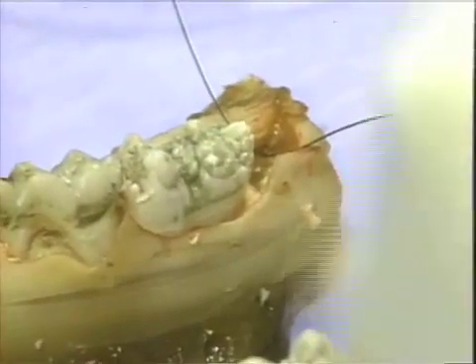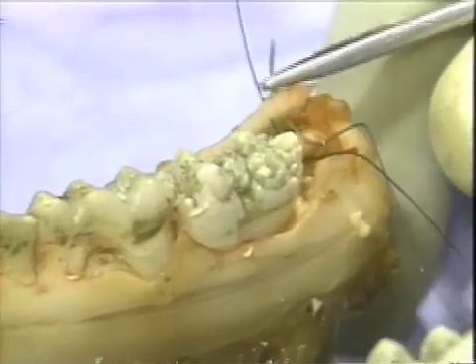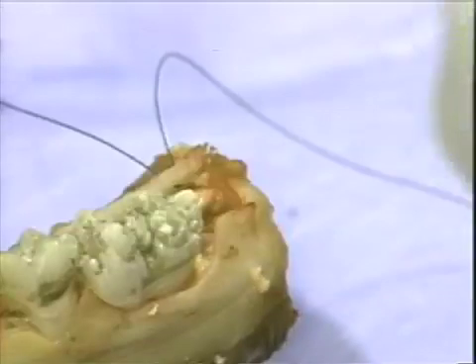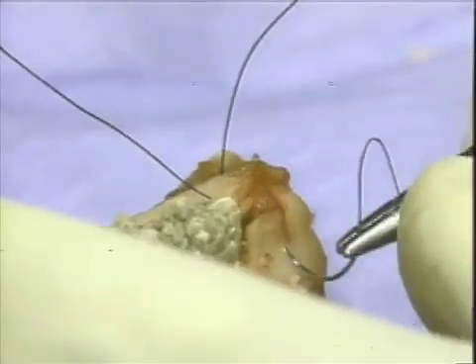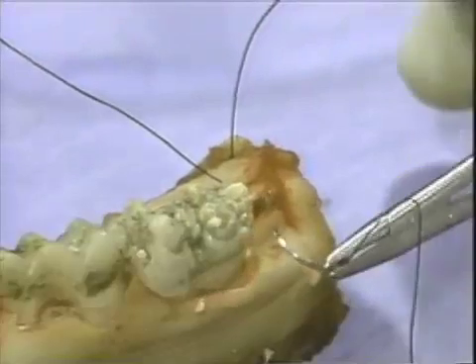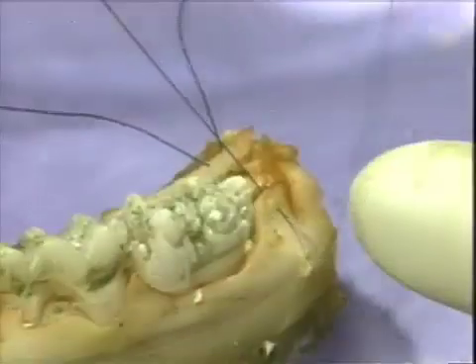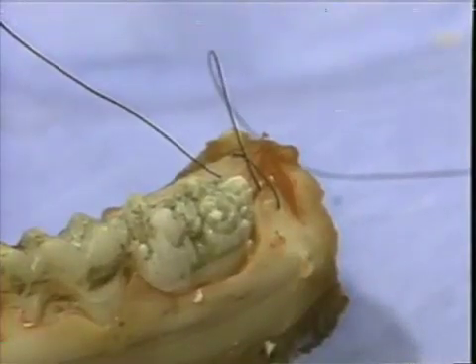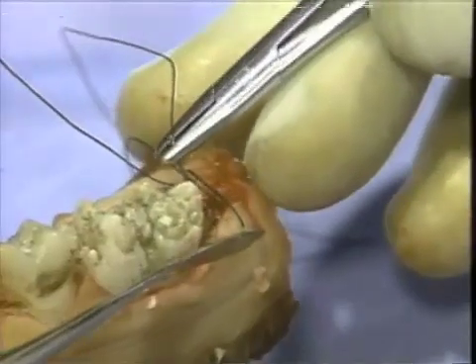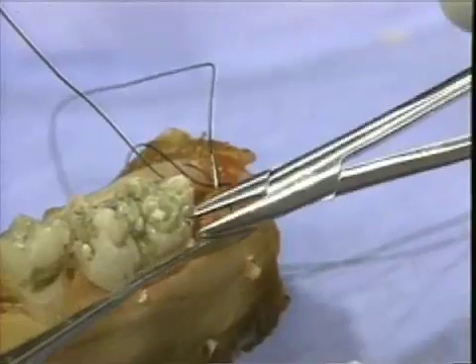The external mattress suture is first placed in either the buccal or lingual flap, and then the procedure is repeated in the lingual flap, using a sequence of placing the suture tip from the oral side of the flap through to the tissue side, back through the lingual flap from the tissue side to the oral side. In this way, the bulk of the suture material lies external to the incision and rests on the gingival tissue as it would on a mattress.